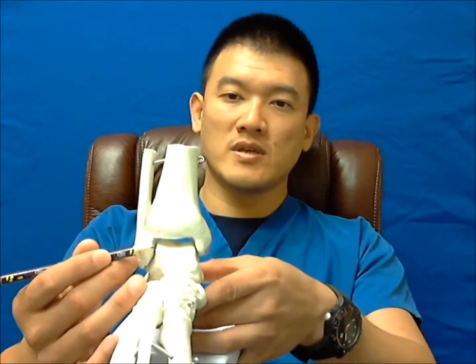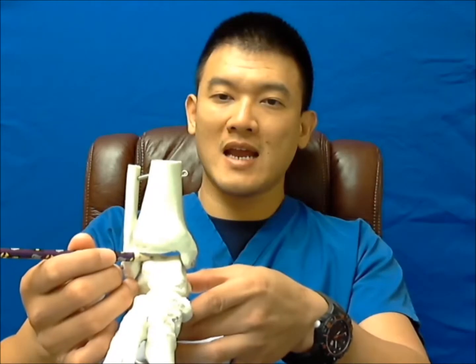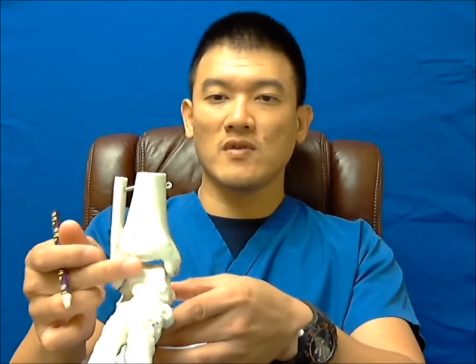Now, how do we treat ankle arthritis or subtalar joint arthritis? In mild to moderate stages, we could do something called an arthroscopy. Arthroscopy basically is a scope we put in one side of the ankle, and I'm going to show footage later on in the video of an actual arthroscope, and you'll get to see what an arthritic joint looks like through a scope. Now, this is the ankle again. We stick a camera in one side, make a small incision of about 5 millimeters, stick a 4 millimeter camera in one side, and then stick something called a shaver or a suction device onto the other side. So you're looking in, and then you're suctioning from the other side.